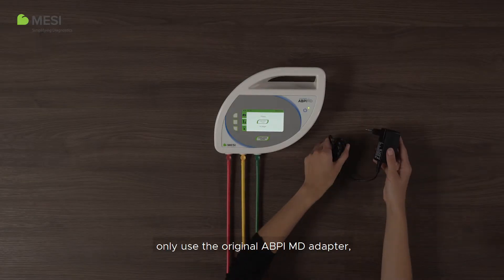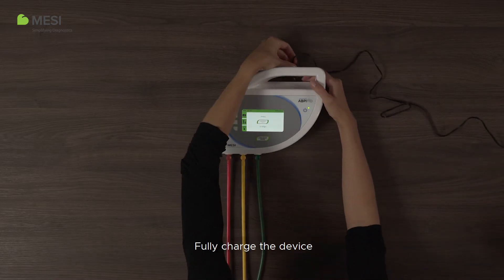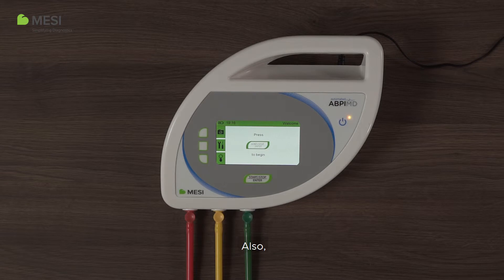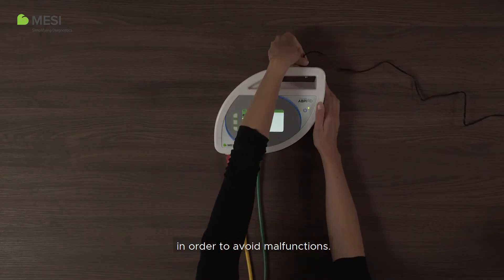For charging, only use the original ABPI MD adapter. Otherwise, the device may be damaged. Fully charge the device when its battery is almost empty, then unplug it when the battery is full. Also, if you plan not to use the device for longer than one month, make sure to fully charge the battery beforehand in order to avoid malfunctions.